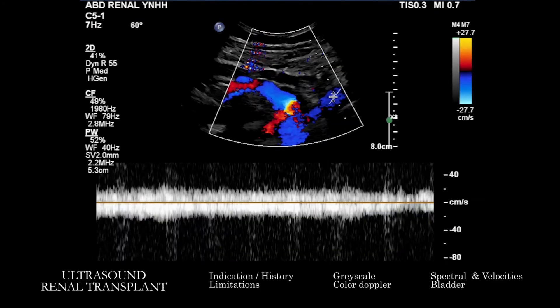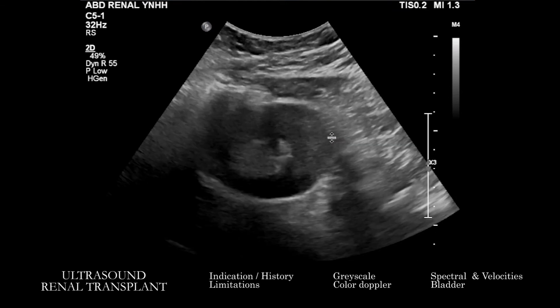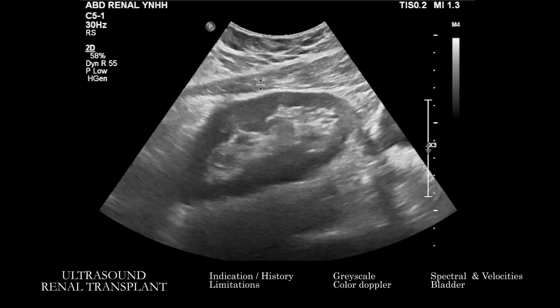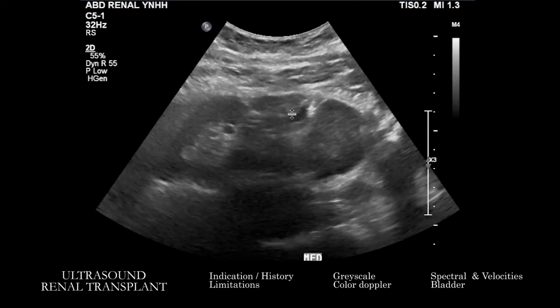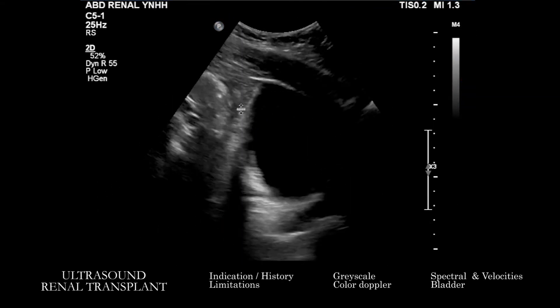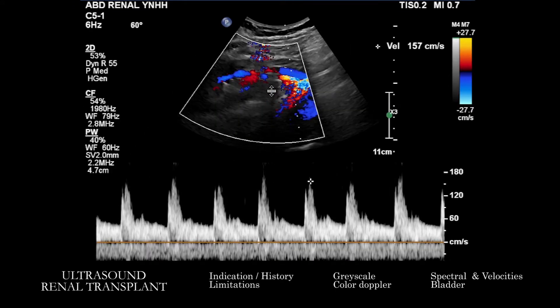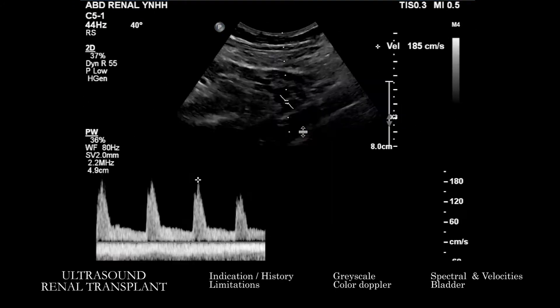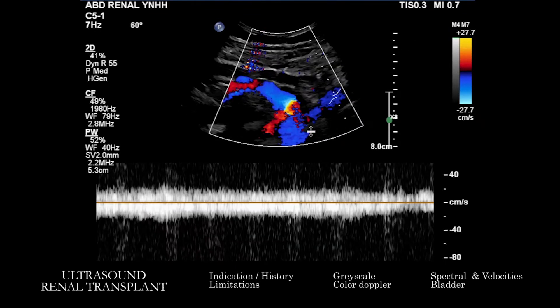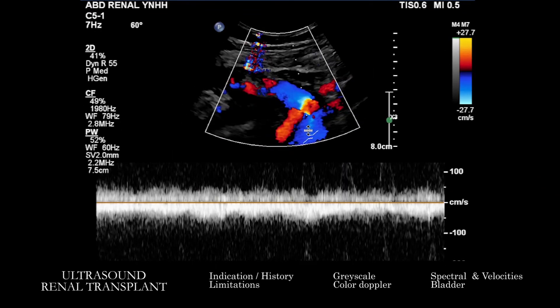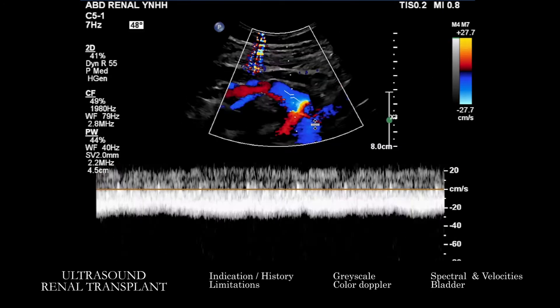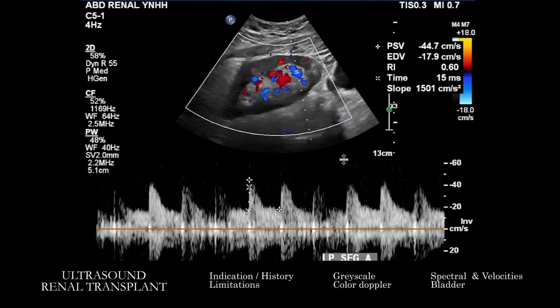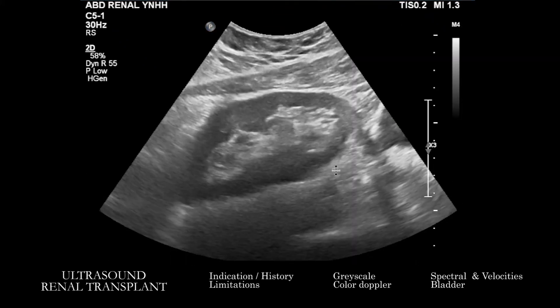And then we have a whole bunch more spectral Doppler through areas of interest. At the beginning of this study we see the kidney, measurements within the kidney, appearances of the kidney and the bladder. And then this is the vasculature that attaches the kidney to the external iliac system — arterial and venous — and then some things near the hilum at the end.